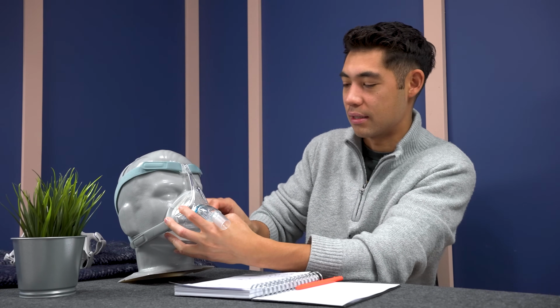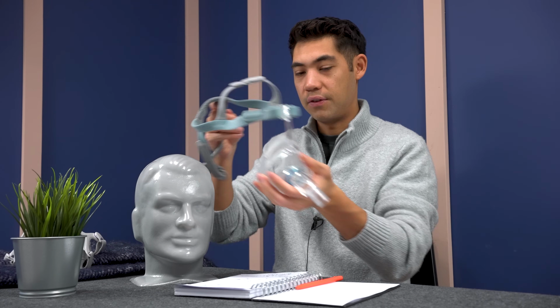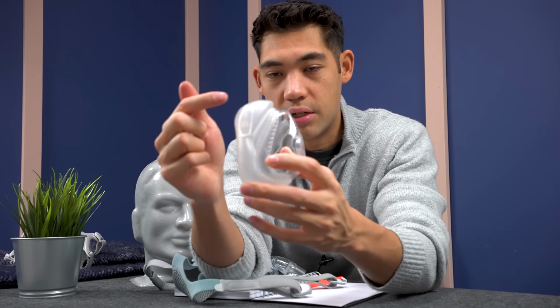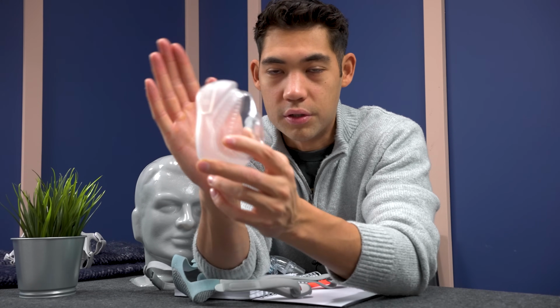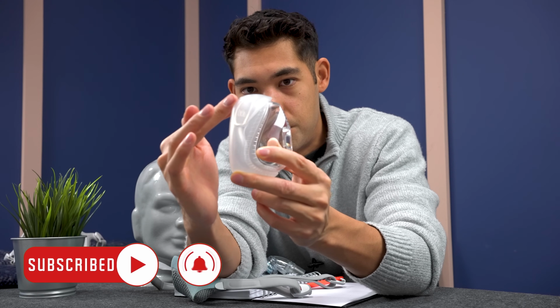Okay, the last thing I want to talk about with this mask is the cushion, which has this little feature here where, as you can see, it's not just silicone that goes straight into the hard plastic. I hope you can see this, but it has this relief area. So as you press it, it doesn't have any more pressure, but it kind of folds like that. See that, how it works?